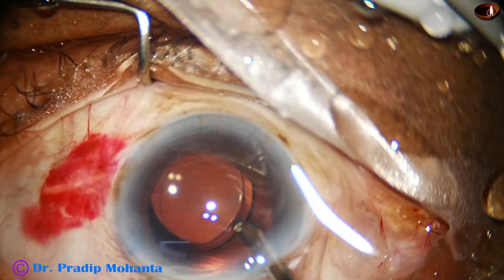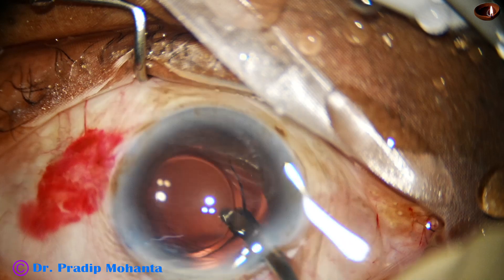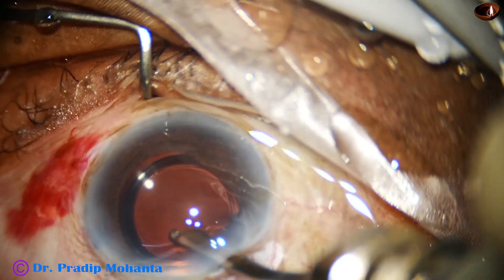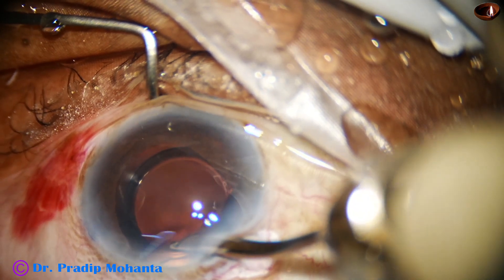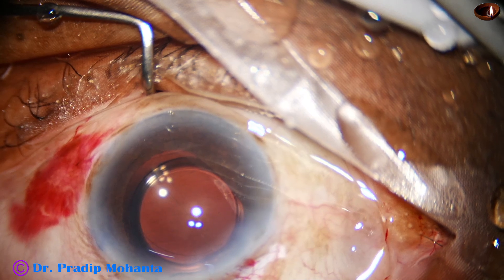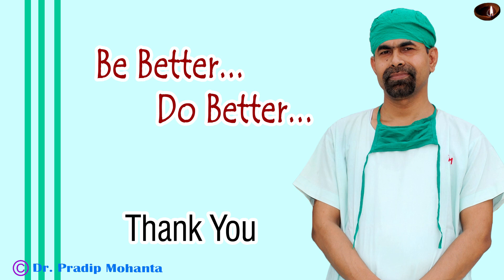We want comfort of the patient. We want good vision for the patient. We are hands of God and we just want to serve mankind with good vision as ophthalmic surgeons. Here we check the integrity of the wounds and conclude the case. Thank you very much for your attention. Hope this video will help you in developing your surgical skills. Be a great surgeon and serve your patients with love, respect, empathy, compassion and great surgical competence.